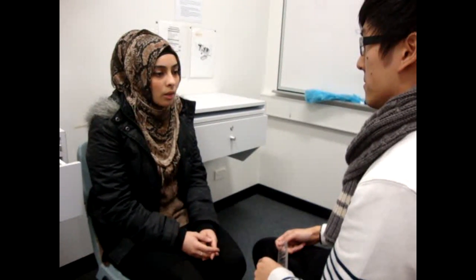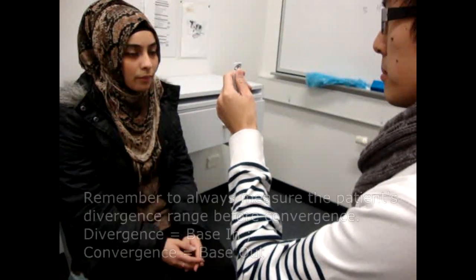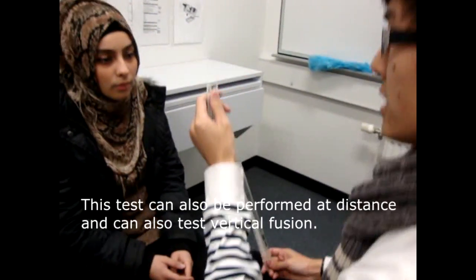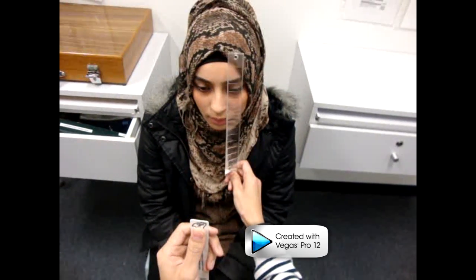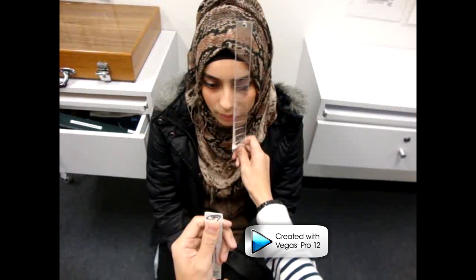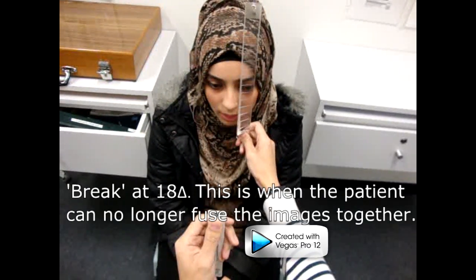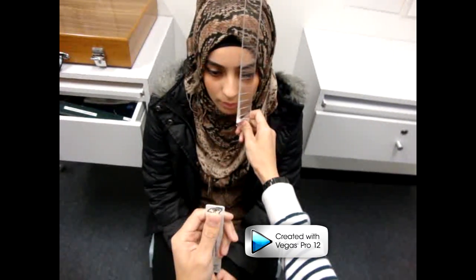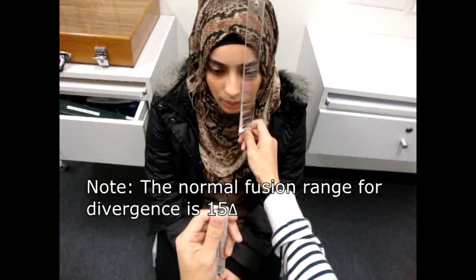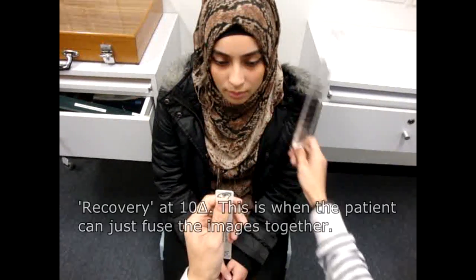Now performing the prism bar fusion range. This tests the patient's fusional convergence and divergence ability. Okay, I'm going to get you to look at this O for me, please. And keep looking at that and tell me when the O becomes double. Yep, just there. The patient has indicated a break at 18 diopters. And now I'm going to go back down and please tell me when the O becomes 1 again. Yep, there. The patient has indicated a recovery at 10 diopters.